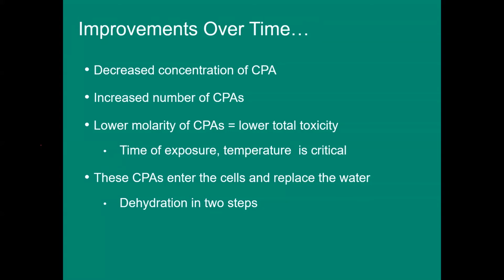So the cytotoxicity effect is also related to time. When we try to vitrify in a high concentration of cryoprotectant, we need to be really careful about the time. From the studies, we reached the point that we can dehydrate the cells in 2 steps rather than 1 step, what we now call the equilibration period and then the vitrification period.